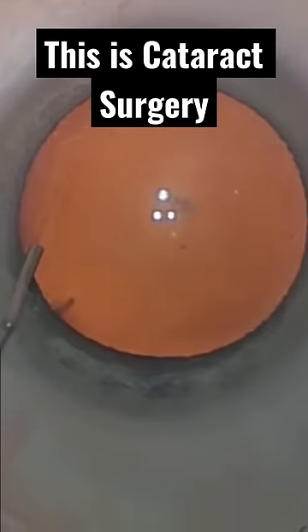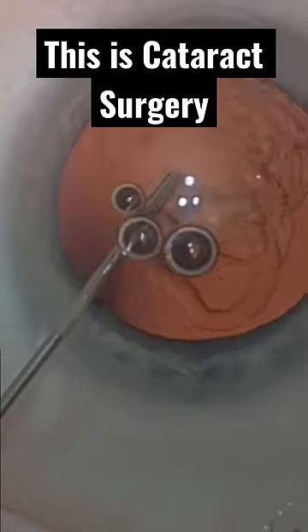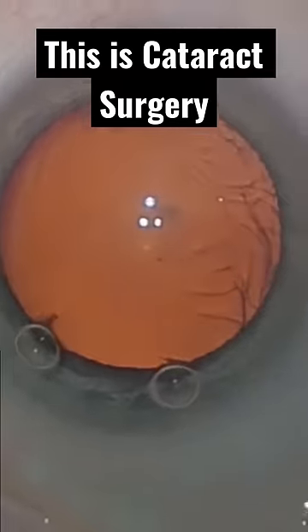A small incision is made on the edge of the clear cornea and a little more numbing medicine is injected inside the eye. A small amount of support material that we call viscoelastic is then injected to keep the eye full.